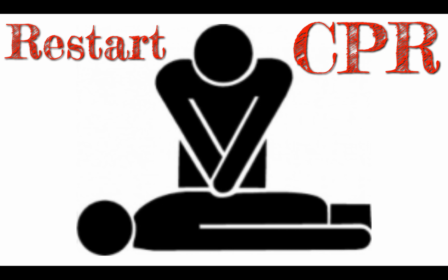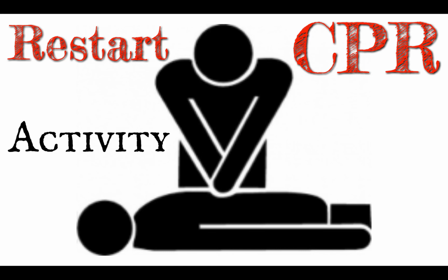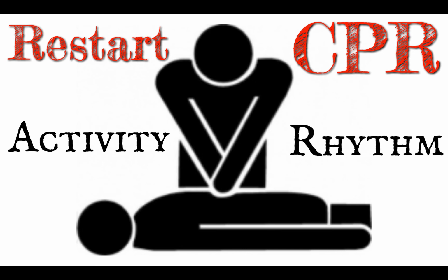Get out the way! I cannot stress how important it is for you to move. Get out the way, let the compressor resume compressions, and now you can look at your clip and interpret it. Look for activity and decide, is the heart even doing anything? And then, if you do see activity, you can start looking at the differences between the mechanical and the electrical rhythm and start doing something about it at the next rhythm check.